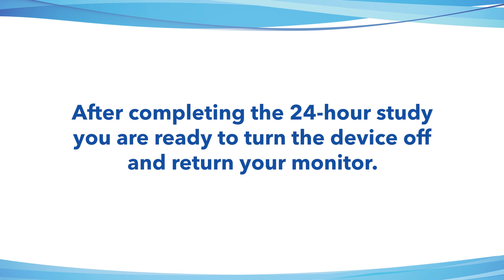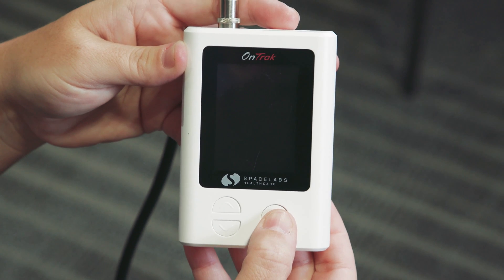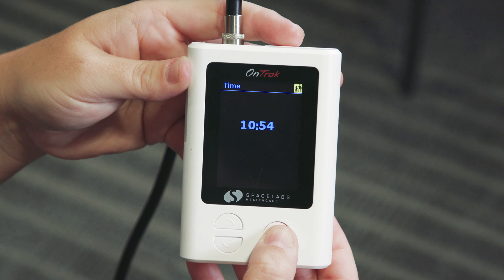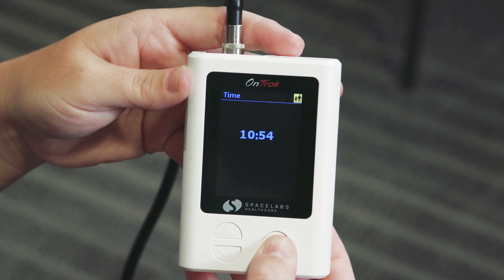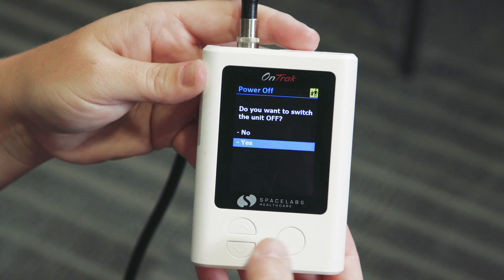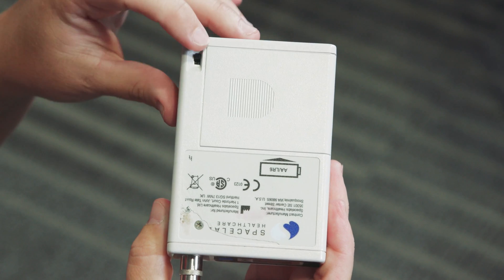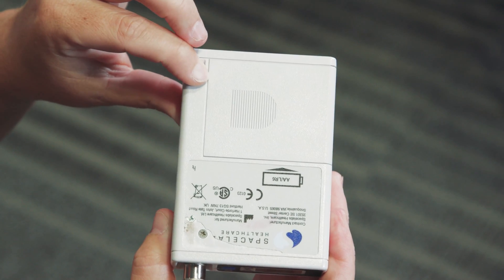After 24 hours, you can turn the monitor off. On the OnTrack 90227 monitor, press and hold the circle button down until the device asks, 'Do you want to switch the device off?' Highlight Yes. On the 90217 monitor, slide the black button down.